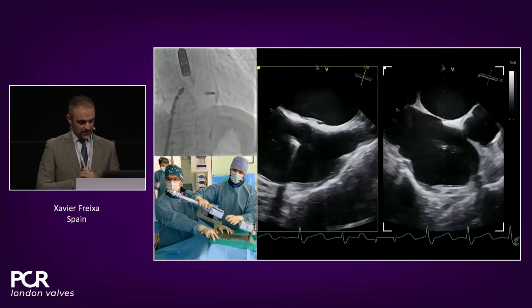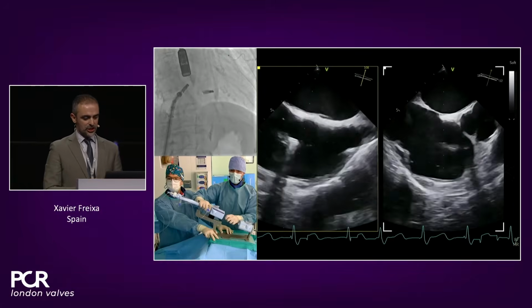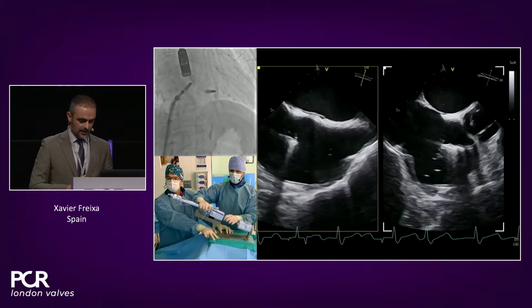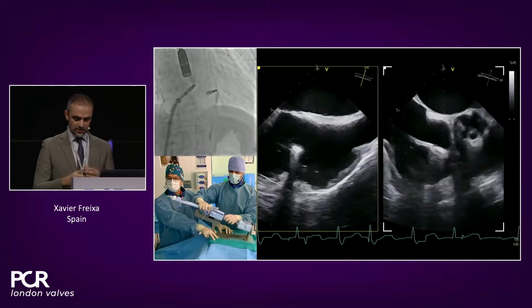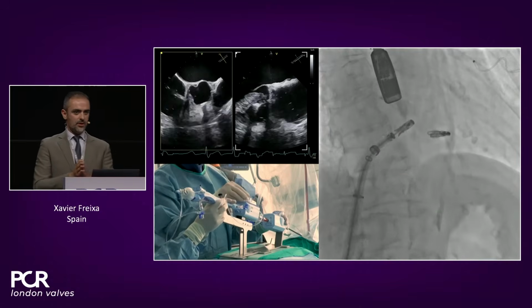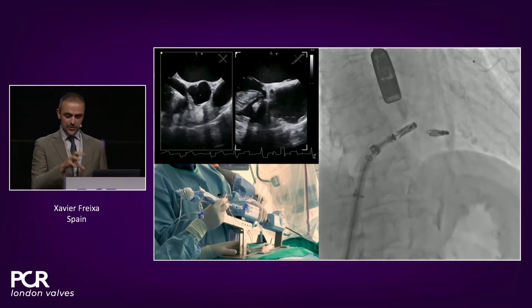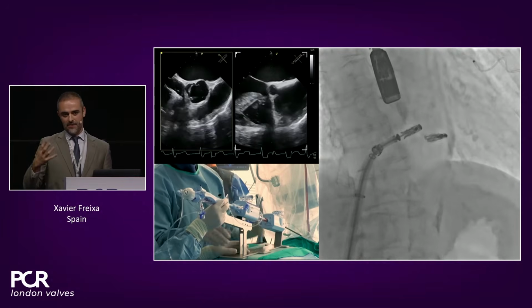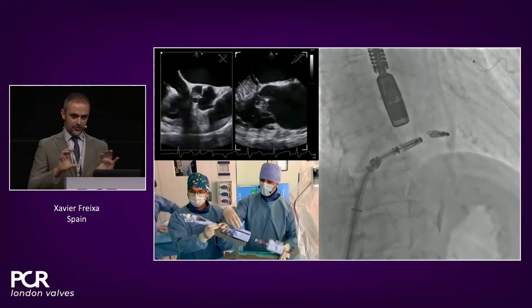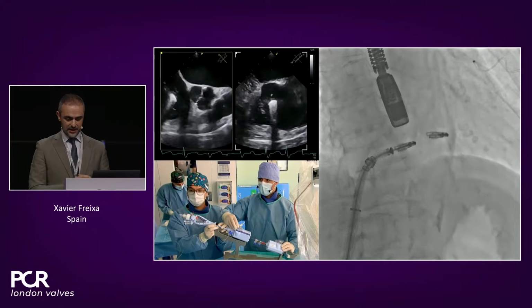Plus, you also know the right orientation. So again, as you can see, Dr. Regueiro here is pulling back from the stabilizer. I keep the position of the clip. Laura is checking that we're not interfering with any structure, that we're not damaging anything. And that's why I put the fluoroscopy large, because it's really useful, once you have implanted the first clip, to try to be parallel to this first clip. Try just to replicate all the knobs and all the turns that you applied.